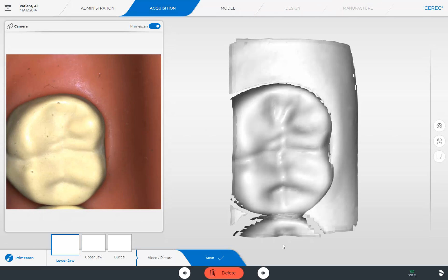The starting point is always occlusal at the most distal tooth, regardless of whether this is the lower or upper jaw. A distance of 2 mm between the scanner and the tooth surface is recommended. After the first 3D images, we sweep our PrimeScan by 60 degrees to the lingual and scan to the opposite, most distal tooth.